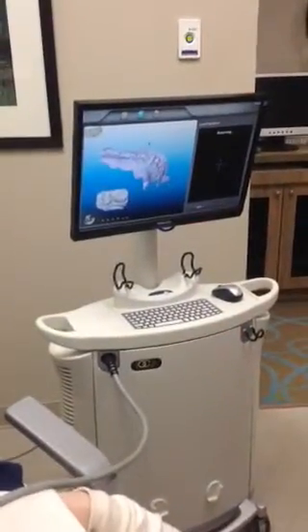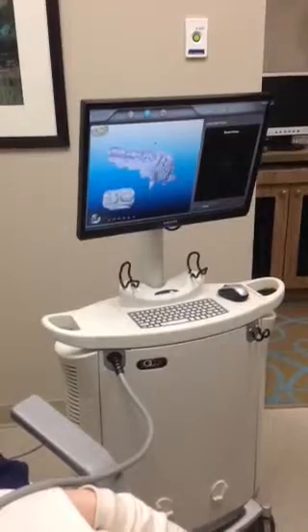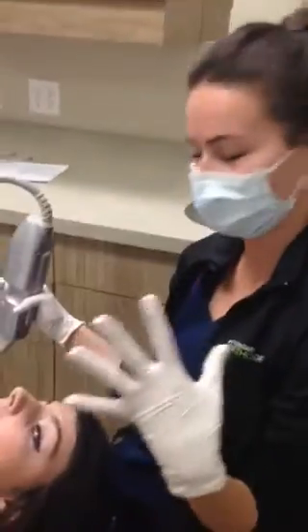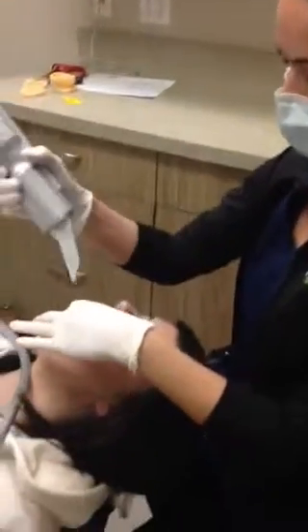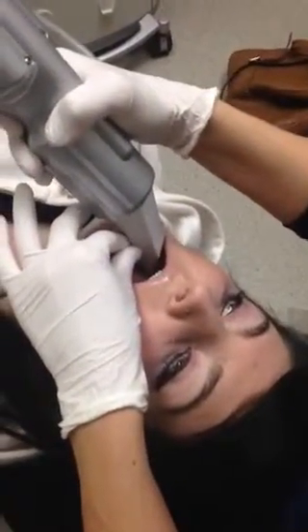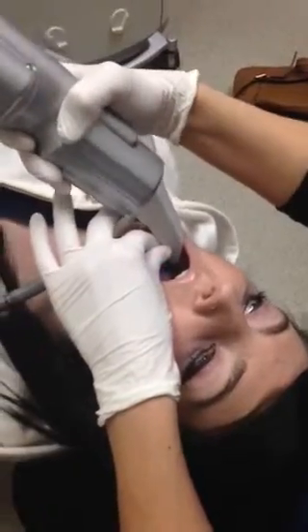So those pictures are kind of existing on the top, and that just means that it needs a reference point in the back. So if I were to take a picture of the 6 and then move over to a picture of the 4, it won't recognize that there's a 5 in between, so you have to go back and scan. Okay. So it's kind of foolproof. That's pretty smart. And it should stitch it all together.